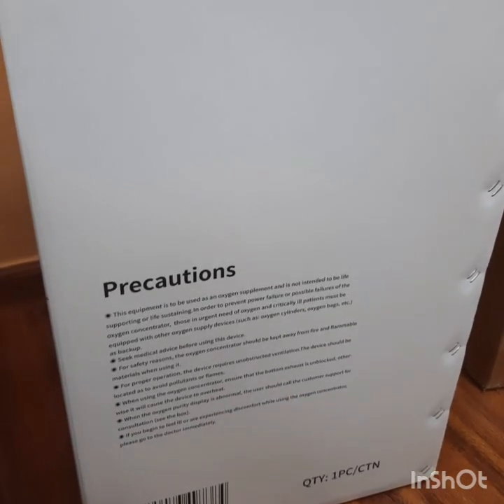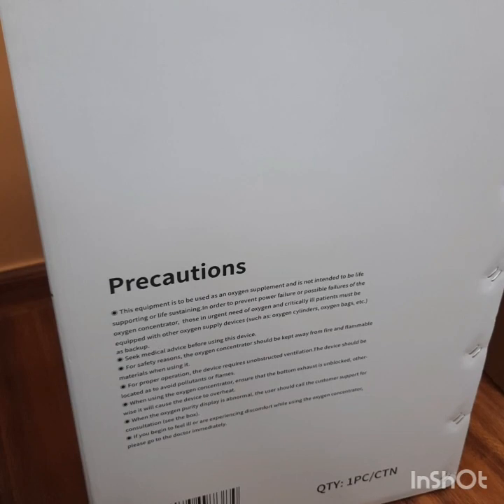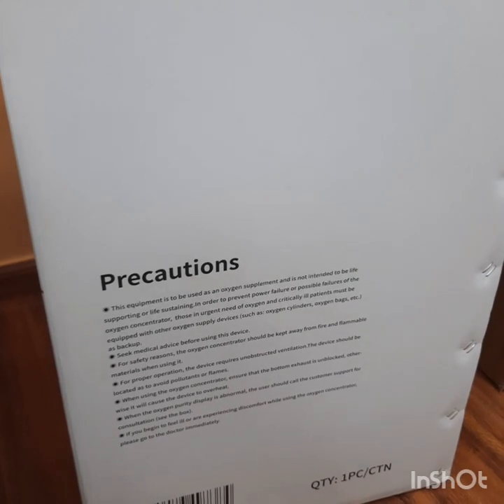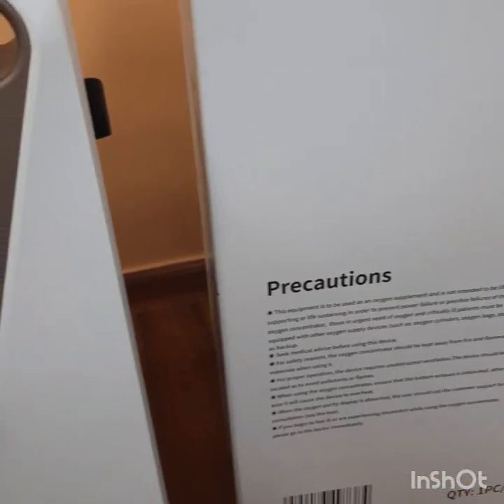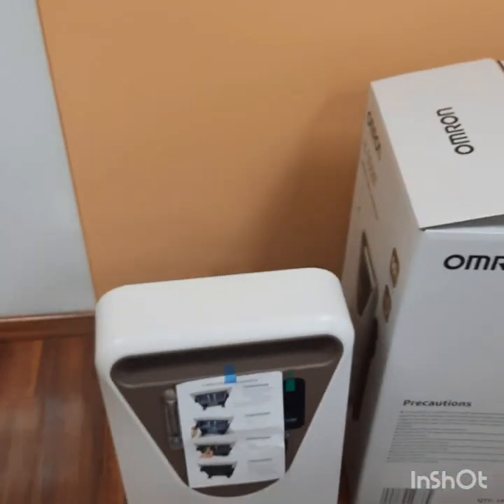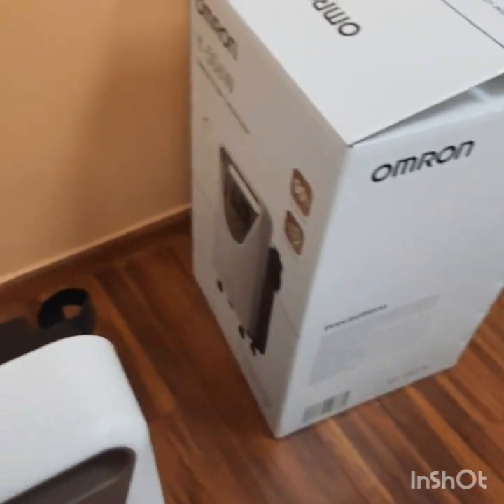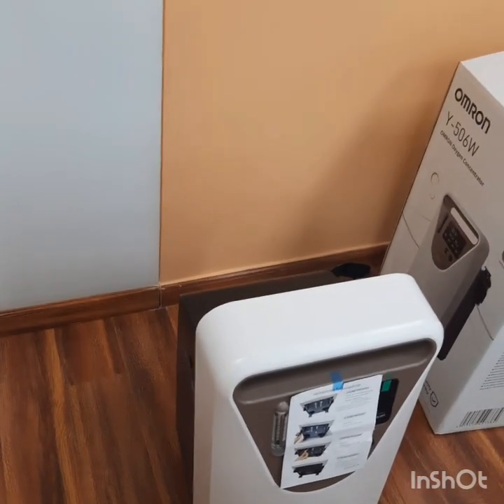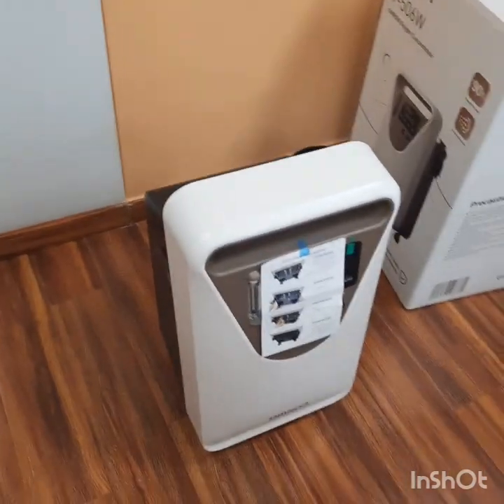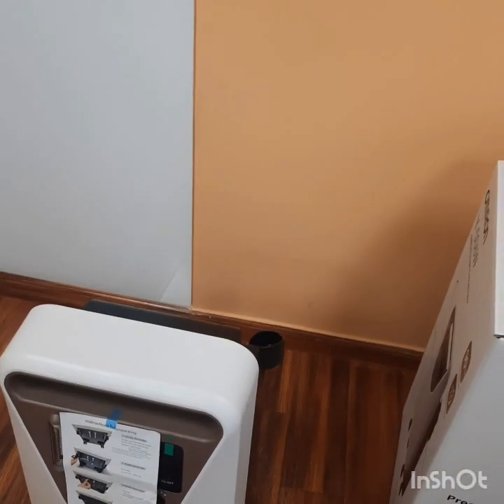Before using the Oxygen Concentrator, the customer must read all the safety instructions given in the instruction manual. For example, the room in which the Oxygen Concentrator is placed must be well ventilated. Also, the Oxygen Concentrator should be placed such that there is at least one foot of clearance on all sides — back, front, right, and left — with no obstructions.